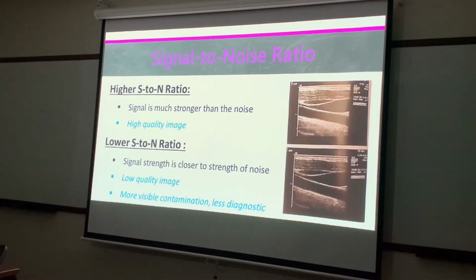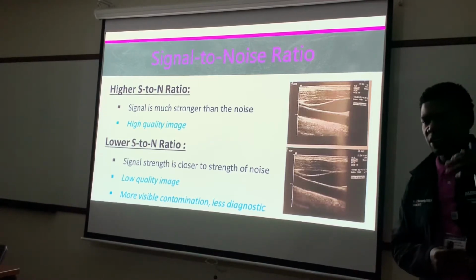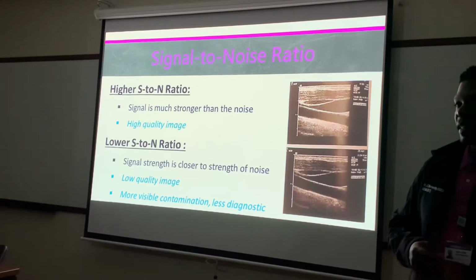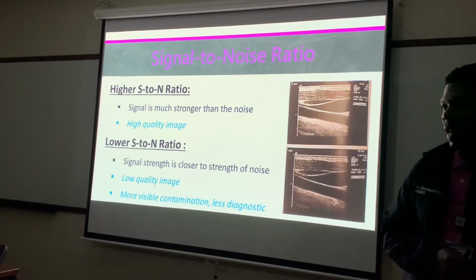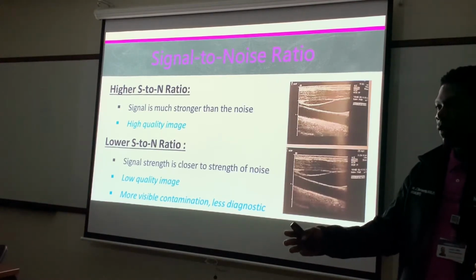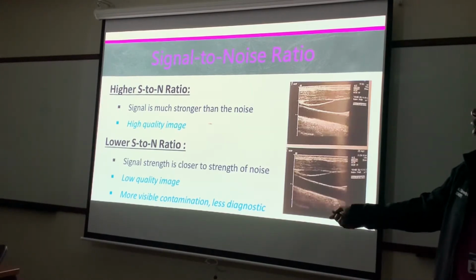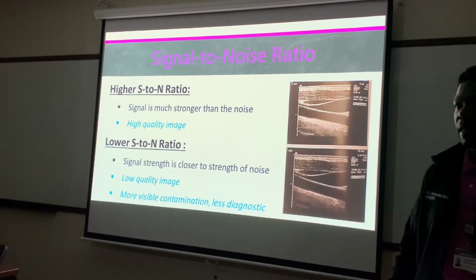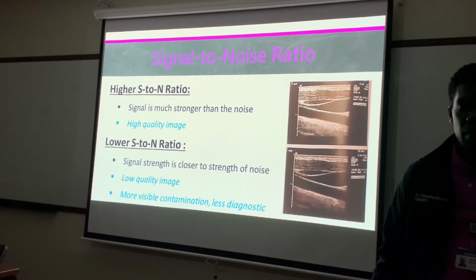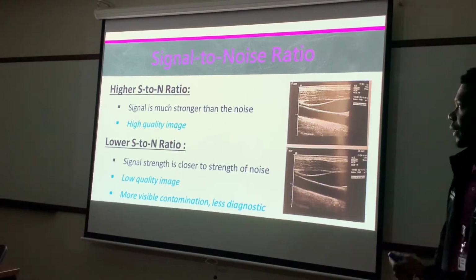You can see clearly by our images here. I would say in ultrasound, or in X-ray as well, it would be like a contrast deal. If we have high contrast, meaning we have harmonics, that would increase our contrast, making our blacks blacker and our whites whiter. We have a real black and white image, correct? That would be a high signal to noise ratio. The signal is much stronger than the noise, creating a higher quality image. That's why you guys like harmonics so much, when it's useful.